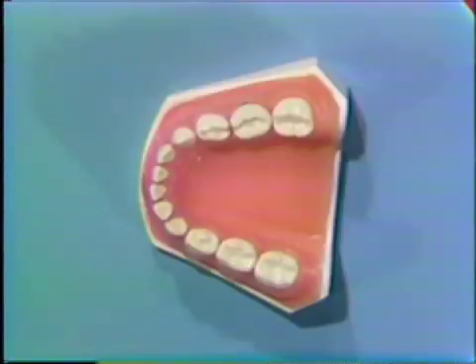During this program, I'm going to show you the steps in the construction of a spot welded matrix band. I'll show the adaptation of the matrix band on a prepared tooth, and then I'll review the steps of the construction and adaptation of the Toffelmire matrix band. The advantage of the spot welded matrix band is that it is a custom-made matrix band, which can be used on a prepared tooth where there is a rubber dam clamp in place.